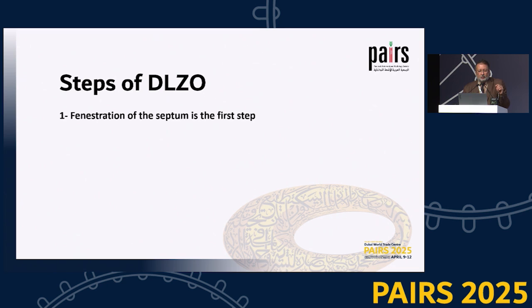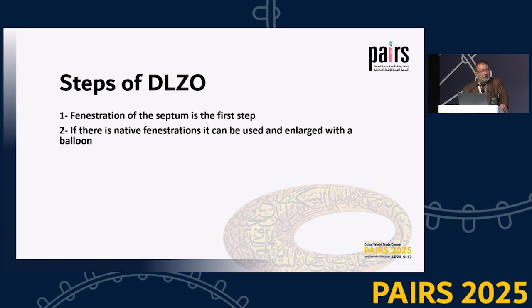Fenestration can be done with a septostomy knife, which is a technique I learned from cardiologists. And it can be done with laser fenestration if you have the option of laser devices in your unit.